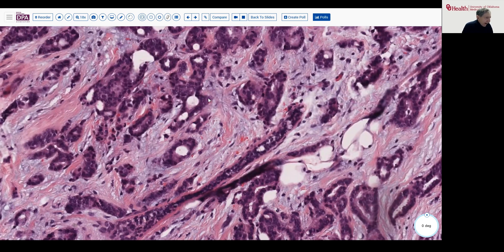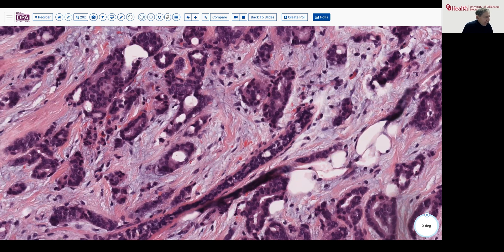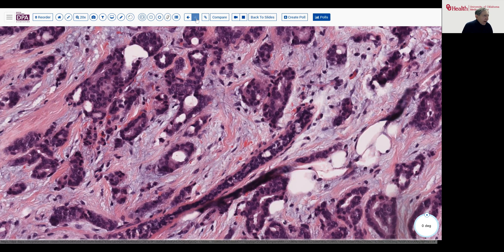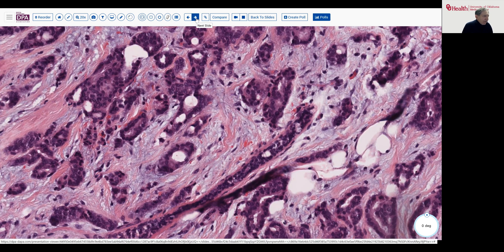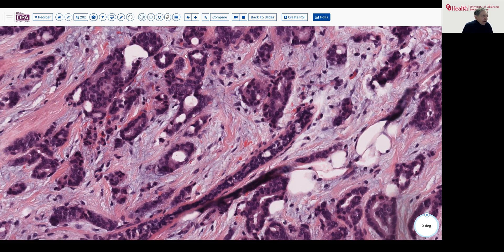Having said that, given that this is fairly low grade and it's making small cystic spaces akin to what we had on the biopsy, it would not be unreasonable to therefore proceed with some immunohistochemistry stains to further substantiate, especially since this was a tumor that was ER/PR positive and so forth. So we do that on the liver.